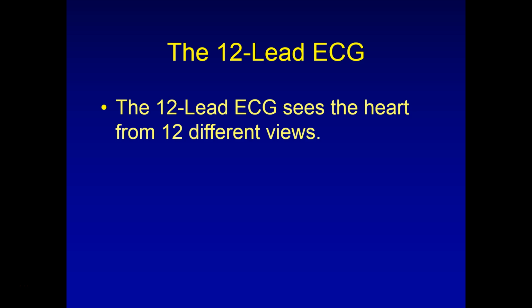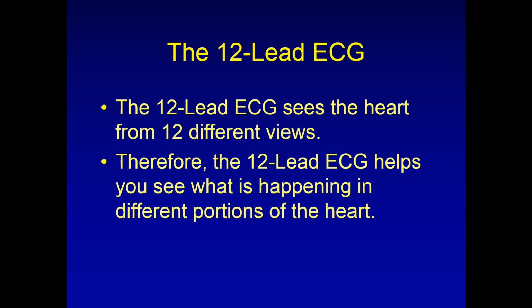So each lead is looking at a different view of the heart. They're like 12 individual cameras located in 12 different positions that give you an overall view of the whole heart. So that's important. It helps us determine where problems are going on within the heart itself.